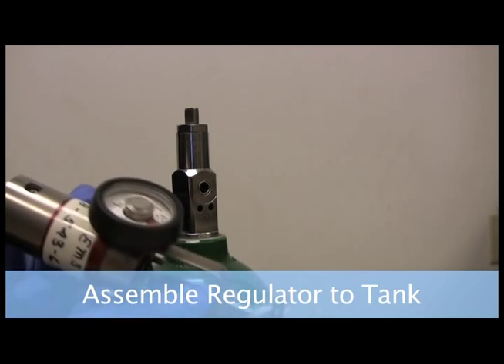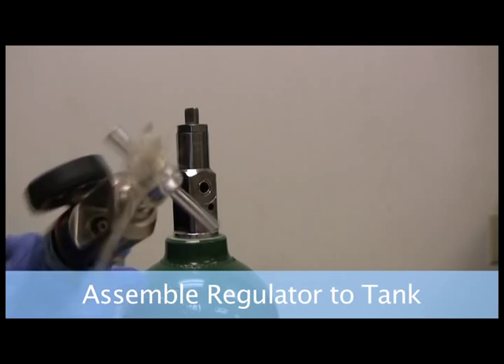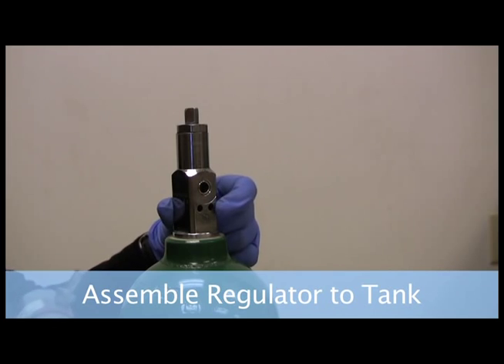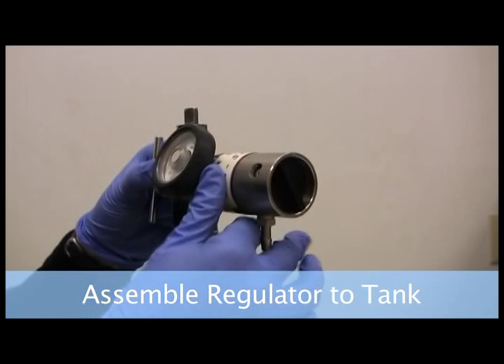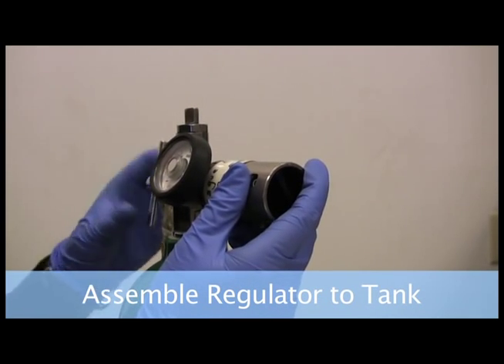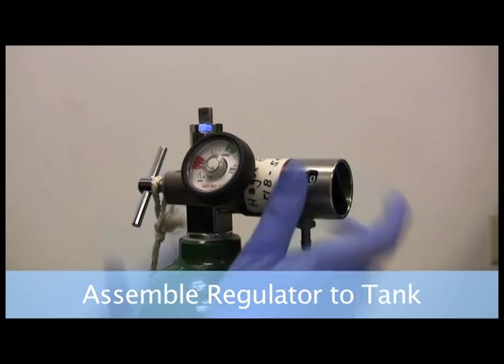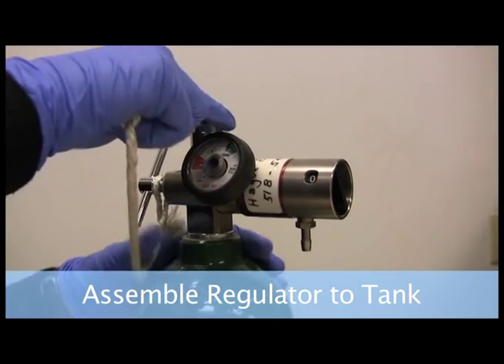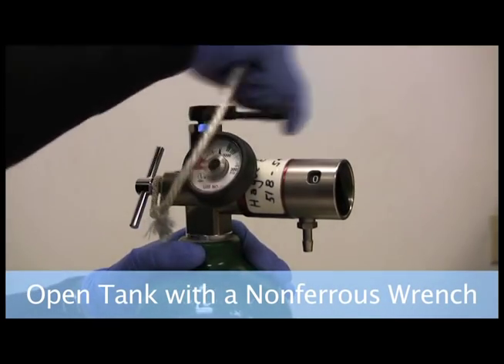I have my regulator all set to go. My cap is already in there, and I'm going to take these two prongs and place them right into those two holes. So after that's on, nice and tight, I got my plastic wrench again, and I'm gonna open it up all the way.